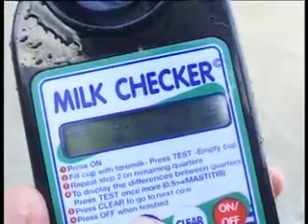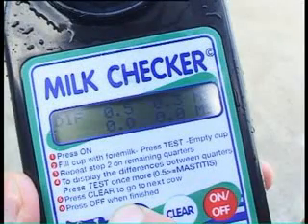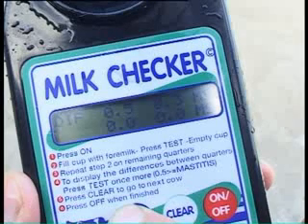After all four quarters are tested, you press test once more and the unit now shows all differences in an instant. Readings lower than 0.5 means a clear quarter. Readings higher than 0.5 means subclinical mastitis. Readings higher than 0.8 means clinical mastitis. To check after antibiotic treatment, repeat the testing. After the withholding period, if all readings are within a 0.5 margin, you have things under control.